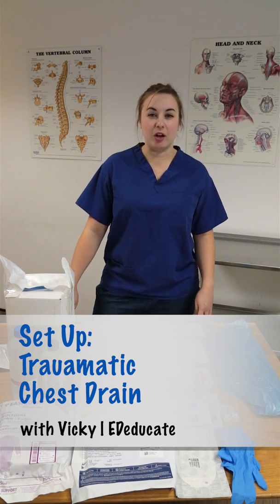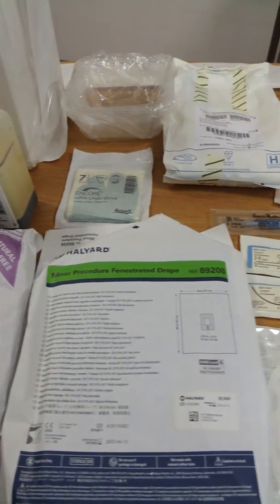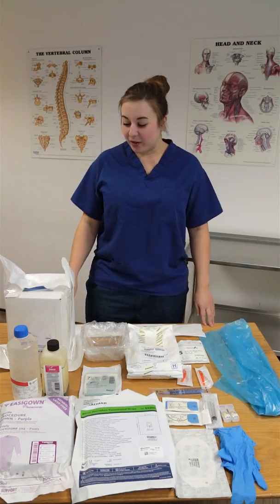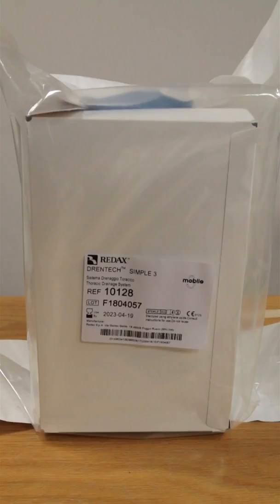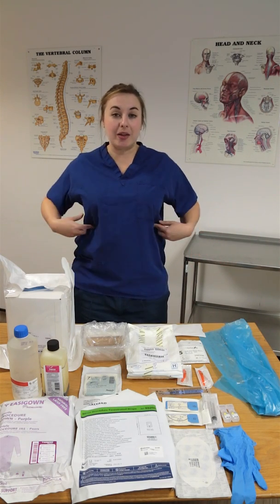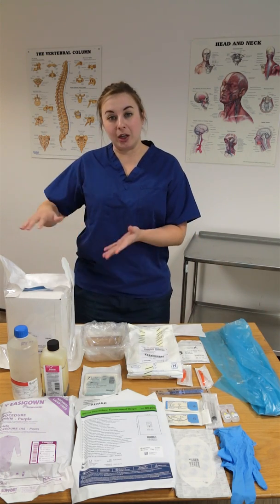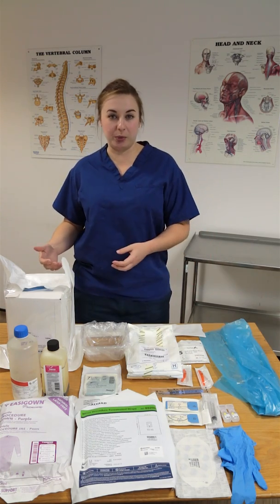In this video we're going to talk about how to set up for a traumatic chest drain — what kit you need, what you're expected to do as the assisting nurse, and some hints and tips. The first thing most people will gravitate towards is the chest drain bottle itself, but the most important thing when the trauma patient comes in is making the thoracostomy — making the holes in the side of the chest — and we can't do that with the bottle alone. We need all the other kit, so set the bottle aside and prep it a little later in the procedure.